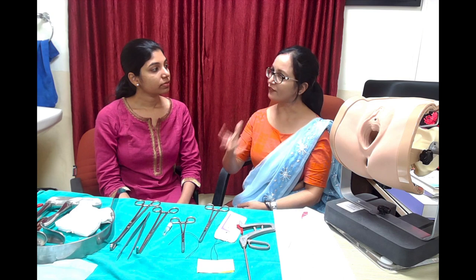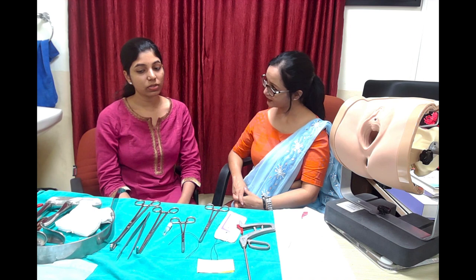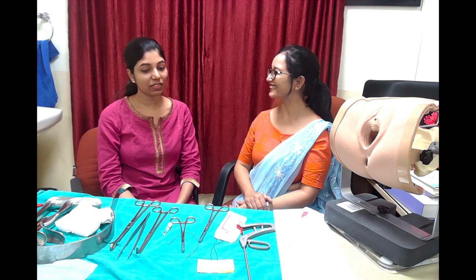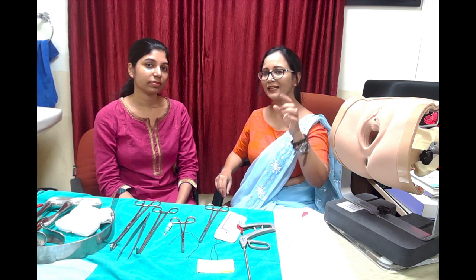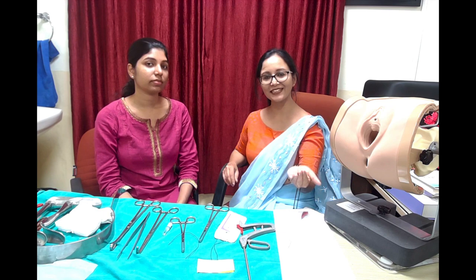To distinguish the two sutures after taking bites, you can use different types of artery forceps — tag one with a straight artery forceps and the other with a curved artery forceps. Alternatively, use two different suture materials: we typically use PDS and Vicryl — both absorbable. You can also use non-absorbable prolene, but it must be buried in the sub-epithelial tissue so it does not lie exposed in the vagina, which would cause chronic infection.